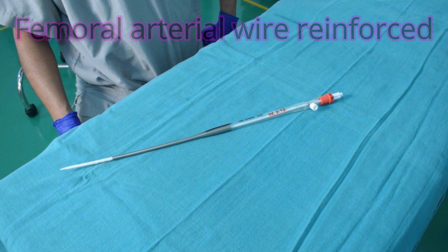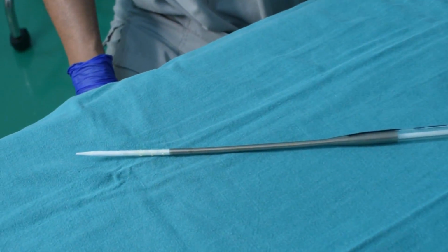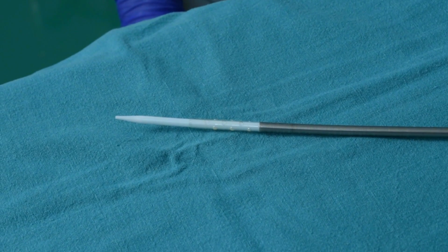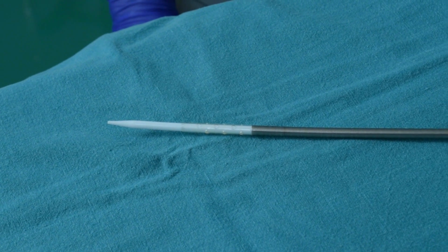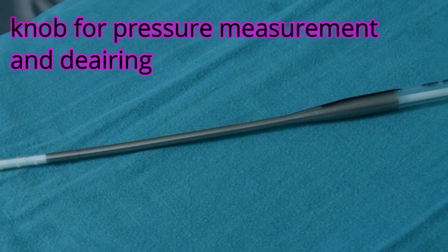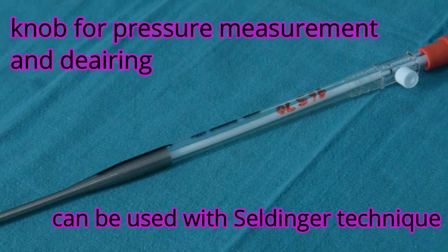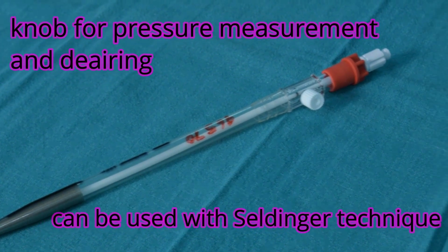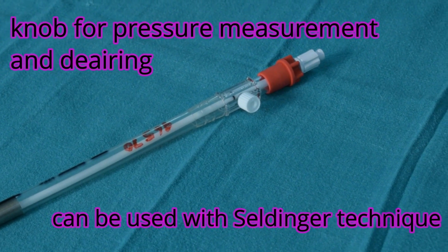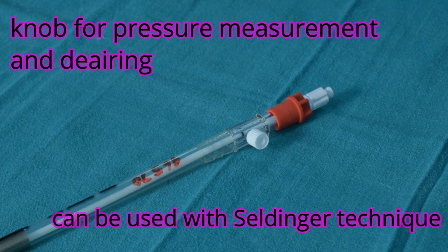Now coming to the femoral cannula, as you know, it is a peripheral cannulation. Peripheral cannulation can be done either with the femoral artery or the axillary artery. So this is a femoral arterial cannula which is wire reinforced. The markings on this will be 5 centimeters apart. The distal end will have multiple holes. The wire reinforcement is for a longer length of the cannula. You have a knob at the outer end, which you can either use to deair or measure the line pressure, especially when it is a case of dissection.